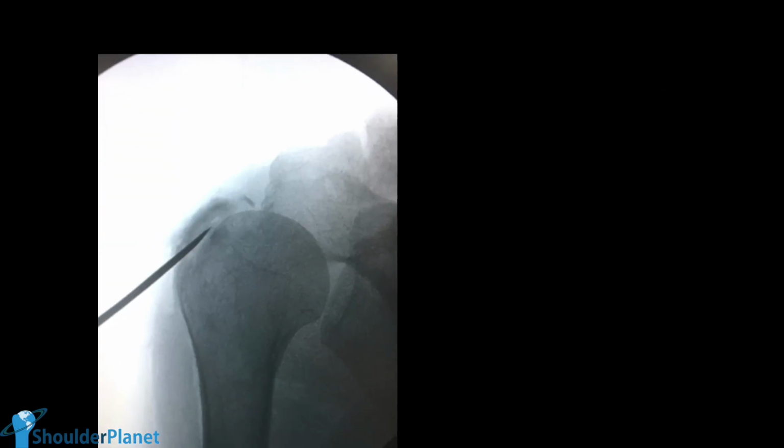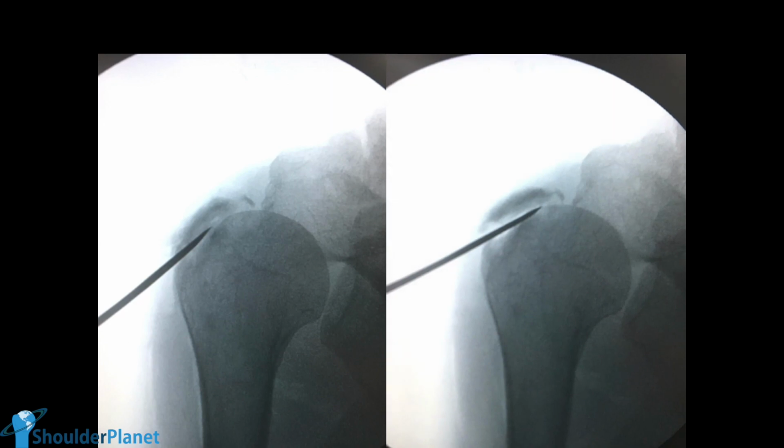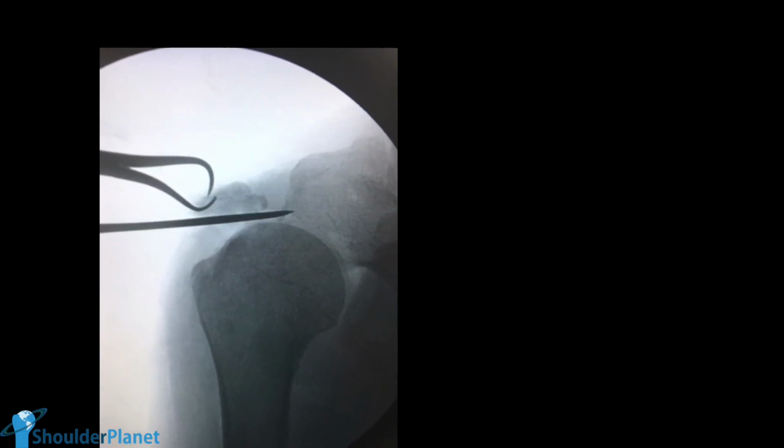And then I go guided by C-arm, so clinically and C-arm guided, and I go very delicately, because when I come to this part, as we've seen on the right side, I cannot damage the cartilage of the humeral head, and I cannot damage the cuff. So all of these movements must be very well controlled. And when I come to this part, I stop, because I don't want to damage the posterior superior cuff.